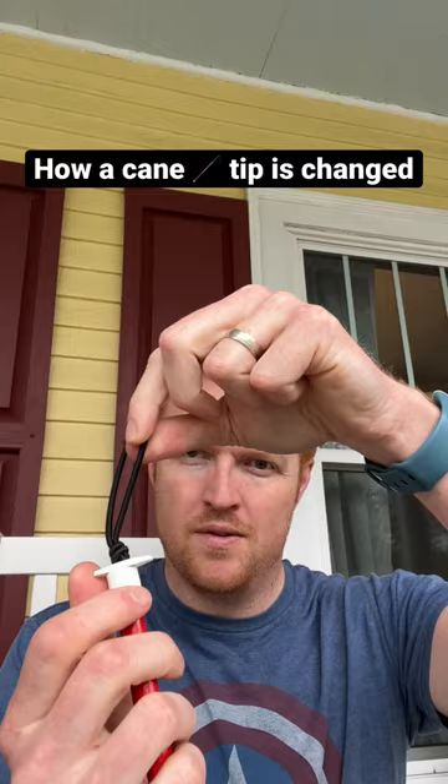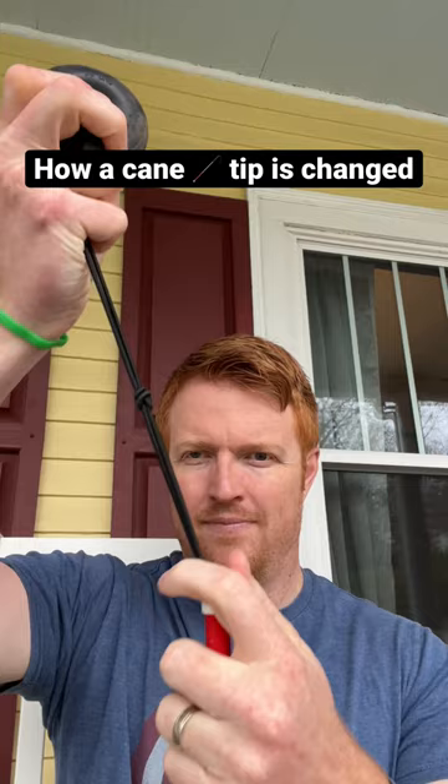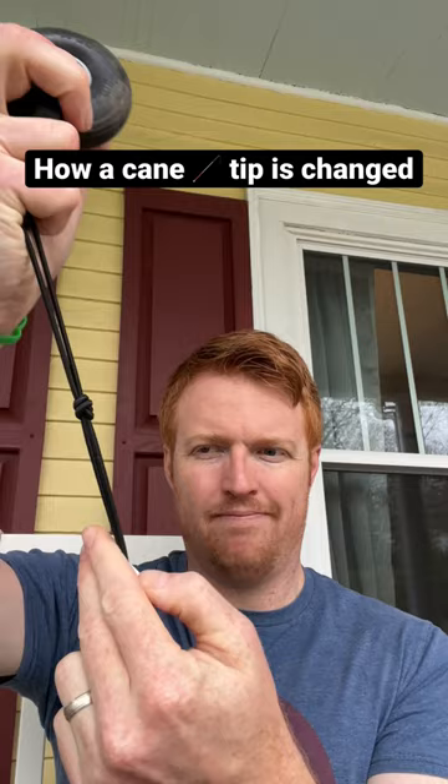Then the new cane tip is hooked onto the loop. This part is a little bit tricky — it's pulled up and that little plastic white stopper needs to be inserted back into the cane until it gets through without getting caught on the knot. When it's in, the whole cord can be sucked back into the cane and now the cane tip is installed.